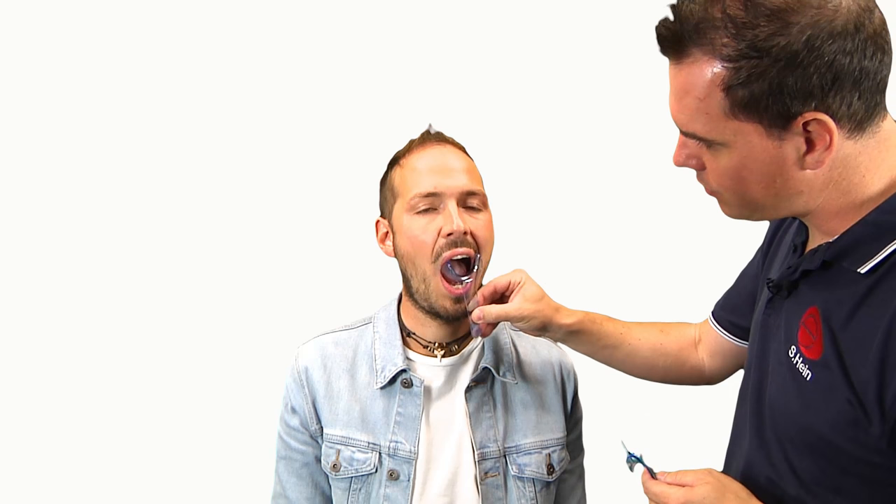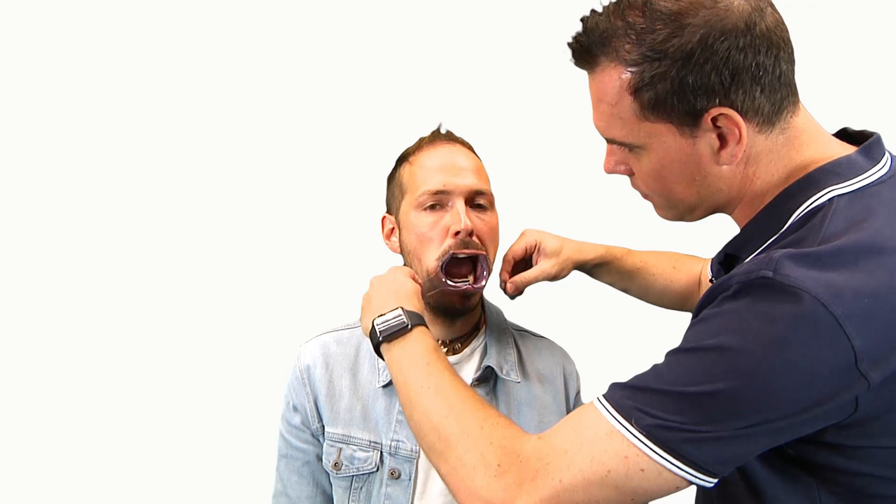What you do is you place the retractors in the mouth — not like this — but first you place them like that, put them in like this and then like that, and same thing here. Then you get the patient to hold them for you. A typical thing patients do is hold the retractor like that, and this is actually going to interfere with your flash. So you want them to move their hands backwards and hold them by the handle.